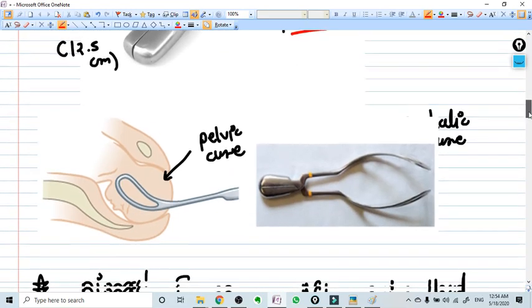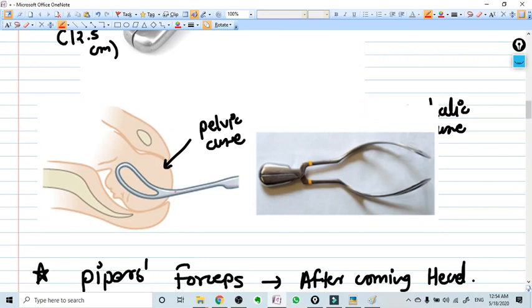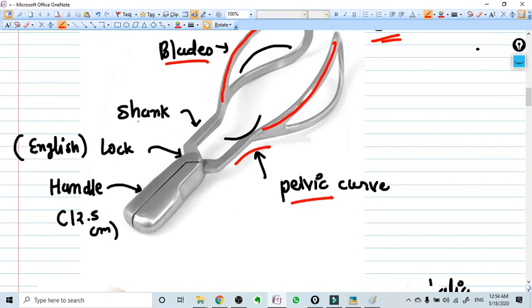This is how you hold the forceps in reality, so the pelvic curve is here. Now these are the shanks and these are the handles. This thing is a lock, the English type of lock is there for anyone who can ask in viva or like that.